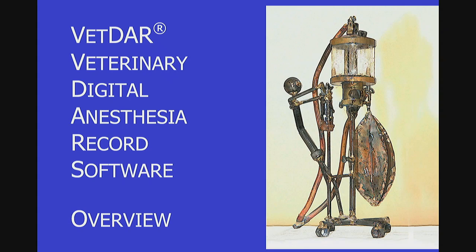Hello and welcome. We would like to introduce you to VetDAR, Veterinary Digital Anesthesia Record-Keeping Software. This software allows one to continue the transition to paperless veterinary medical records. The software adds efficiency, decision support, and safety to veterinary anesthesia.